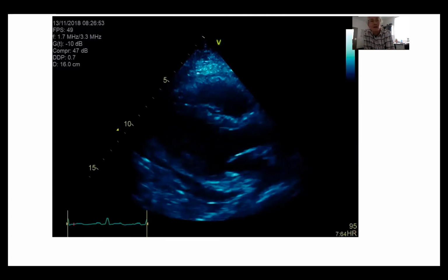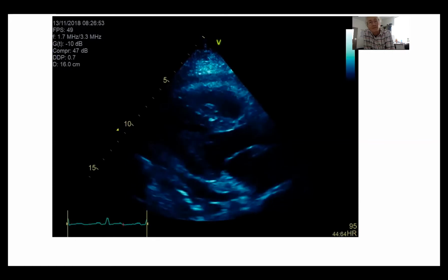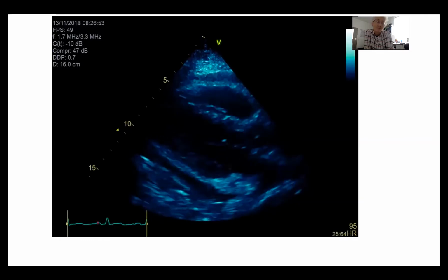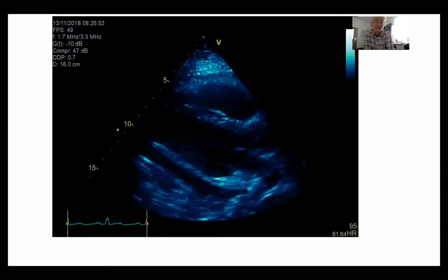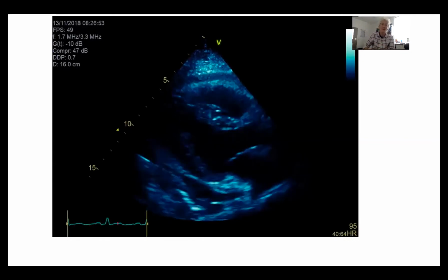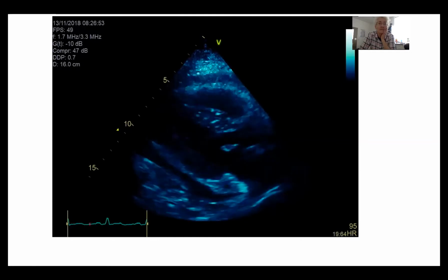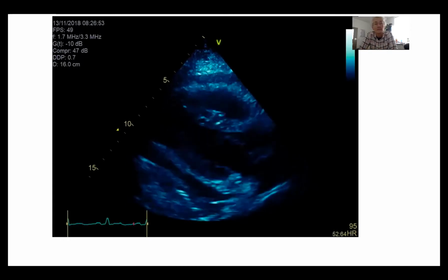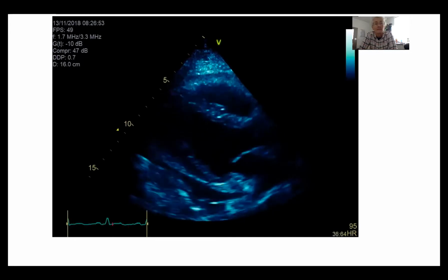Okay, so it's a parasternal long axis view. The first thing that I can see is a pericardial effusion that seems to be circumferential. It looks about 1.5 to 2 centimeters at the most in depth. I'm looking to see whether I can see any signs of pericardial tamponade. I'm looking at the RV free wall, bouncing up and down. I can't see any obvious signs of tamponade. The RV is contracting well, and I think globally the LV systolic function is a little bit down. The valves both seem to be opening normally.